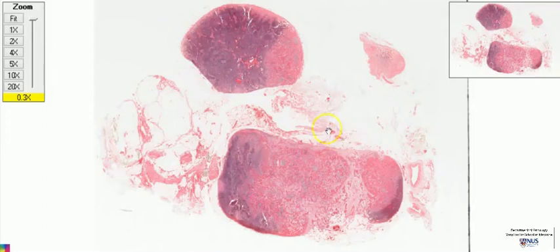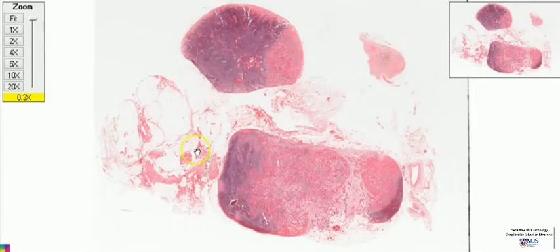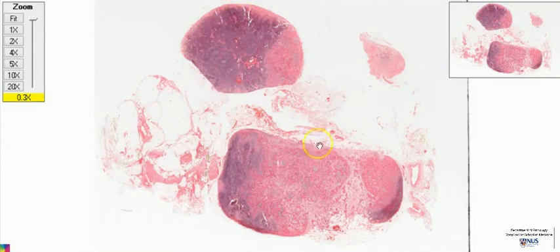This is a microscopy section showing a big lymph node here, a smaller lymph node here, and another very small lymph node. So there are actually three lymph nodes. There are some surrounding adipose tissue and fibrous tissue. So let's focus on the two larger lymph nodes.